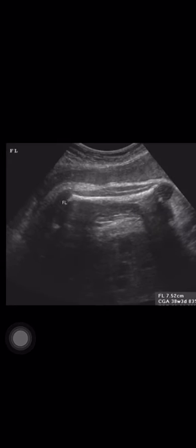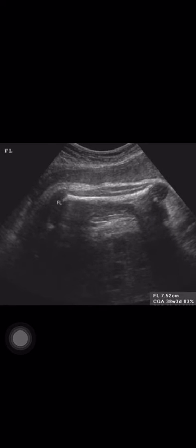In the third trimester, it's not routine to take ultrasound, but it is indicated in some cases, and these are follow-up of placenta previa. If you see placenta previa, you should follow it up, because most of the cases of placenta previa which are diagnosed at the routine scan will resolve later in the pregnancy. The other indication, follow-up of fetal abnormality. If you see fetal abnormality like mild hydrocephalus, you need to follow up this abnormality.